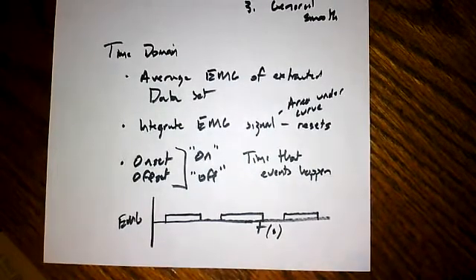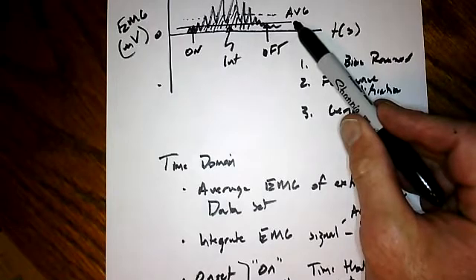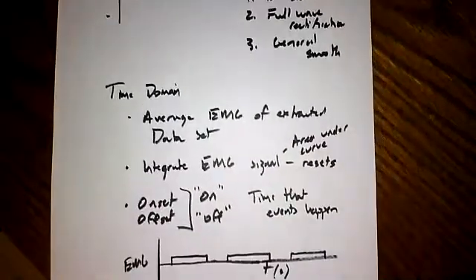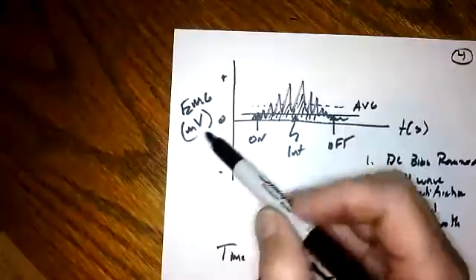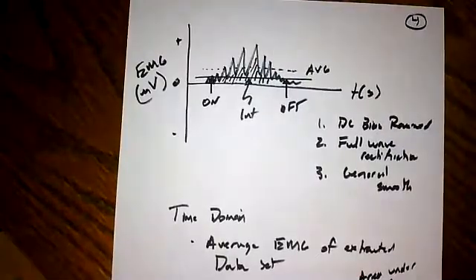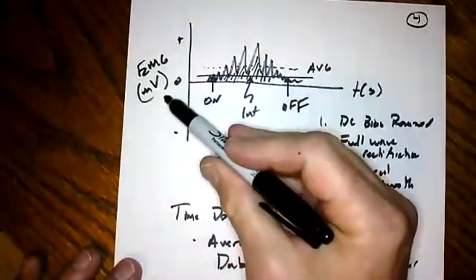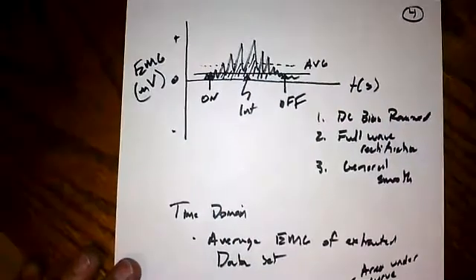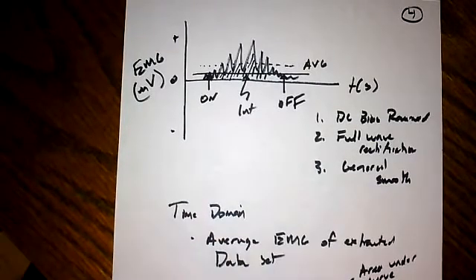Let's see. And in order to do this, I need to be able to identify that threshold. And that threshold often we calculate based upon some quiet period of EMG. All right, now I've kept all these figures in millivolts, all right? One of the things that we do in EMG is we don't use millivolts as our base unit for our analysis or our presentation of data. We normalize the data. And that normalization can actually happen at any period in time, but you need something to normalize the data to.